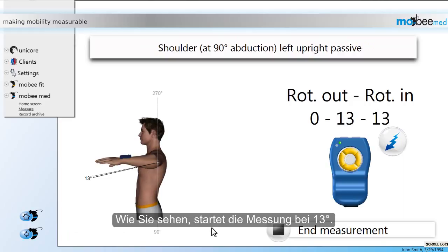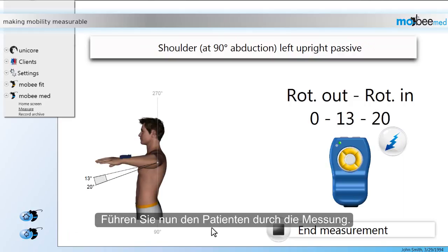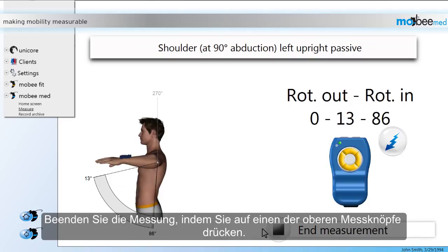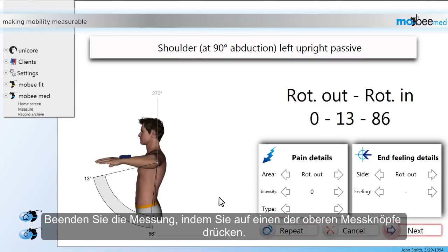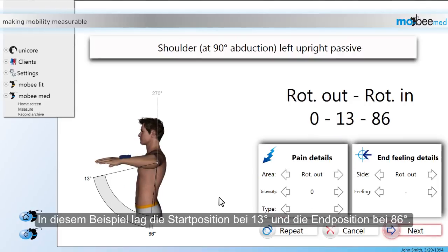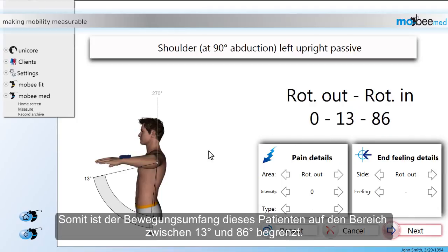As you can see, the measurement starts at 13 degrees. Now you can guide the patient through the movement and end the measurement by pressing one of the measuring buttons on top of the device. In this specific example, the starting position was at 13 degrees and the end position at 86 degrees. Consequently, the range of motion of this patient is restricted to the area between 13 and 86 degrees.